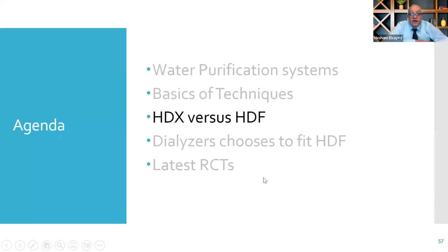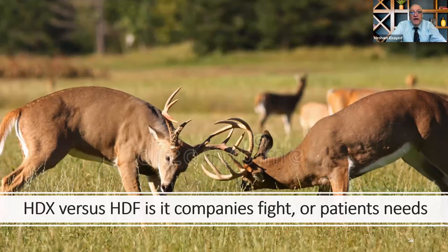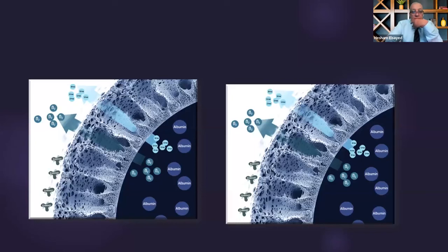Coming to expanded hemodialysis as against hemodiafiltration. In my opinion, it is a company talk, because we have here a comparative analysis between HDX, which is expanded dialysis using the medium cut-off Theranova filter, against high-volume hemodiafiltration, which is by other companies. According to that, expanded hemodialysis is feasible to be used, with comparable results between hemodiafiltration and HDX. However, there is no long-term data on HDX, and albumin loss is greater in HDX techniques, so it could be of less value.